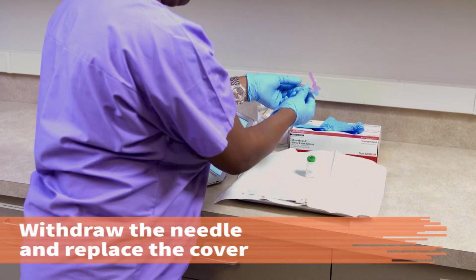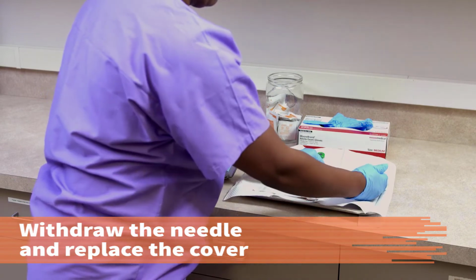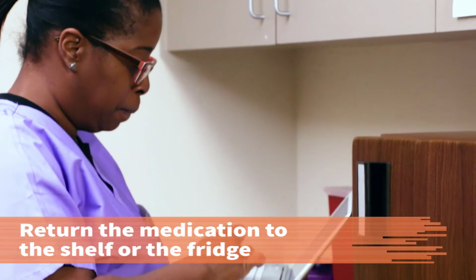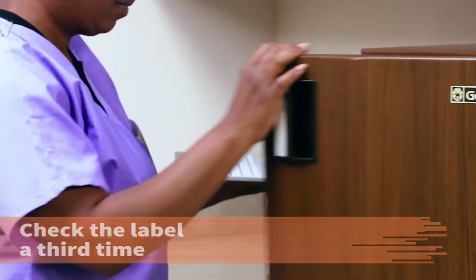Withdraw the needle from the vial and carefully replace the needle cover without letting the needle touch the outside of the cover. Return the medication to the shelf or the refrigerator, checking the order against the label one more time to complete all 3 label checks.